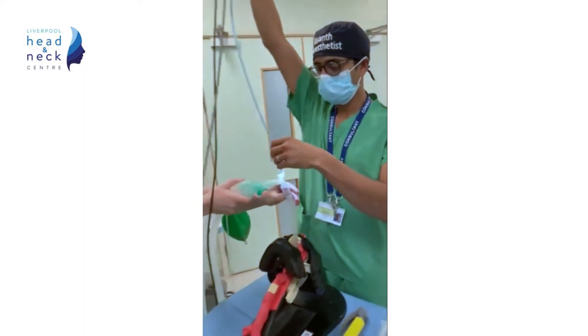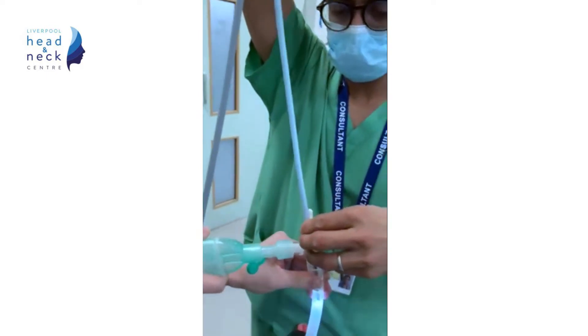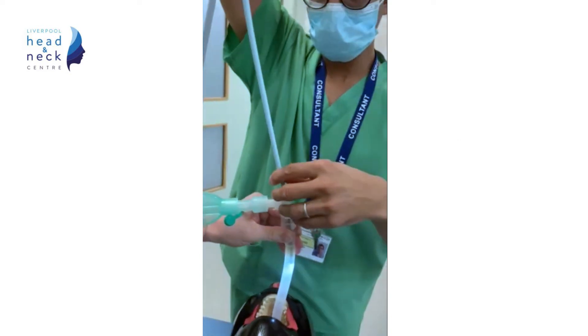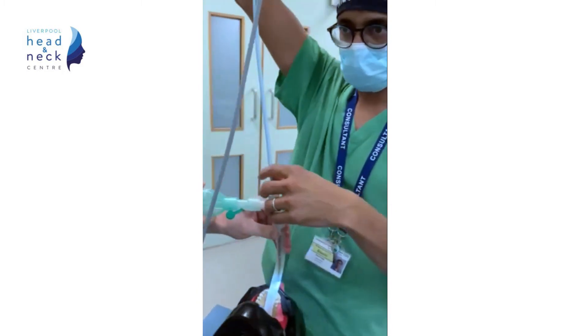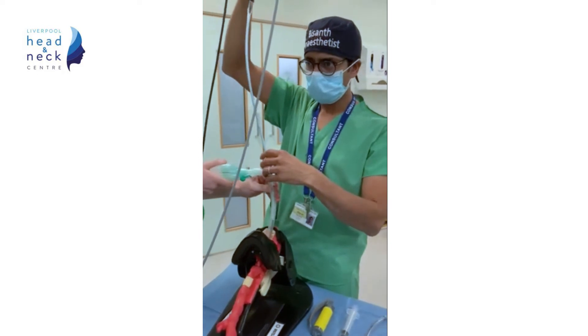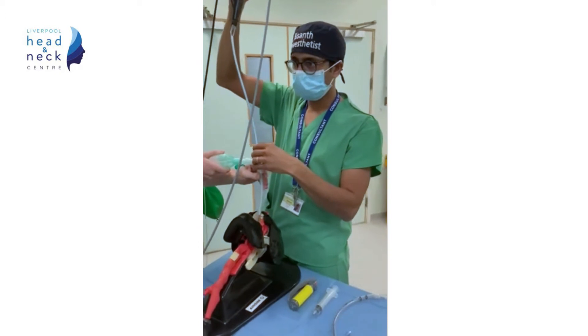The fibroscope is passed through the swivel connector and down through the LMA into the airway. The size of the LMA really depends on the patient; however, a smaller size LMA may be needed in a patient with a difficult airway, where a large LMA may not seat so well.